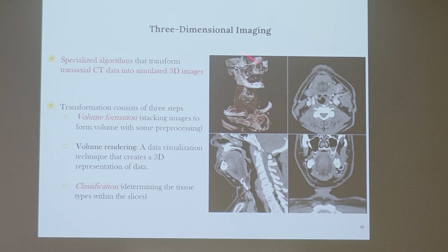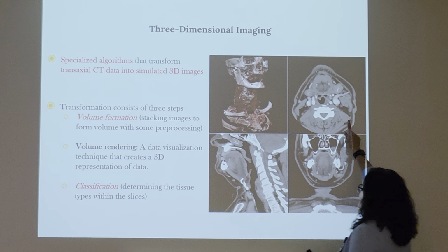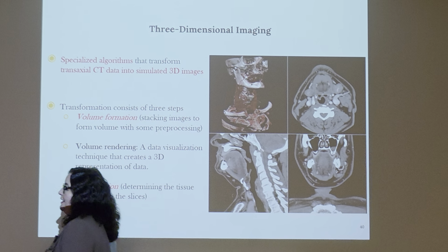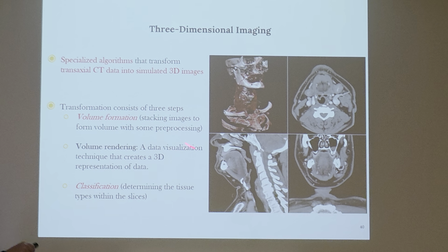3-dimensional imaging, again, this is something that starts from where? Okay, it starts from the axial image. What image is this? Sagittal, okay. And then you have 3D reconstruction. This is where we have the ability to start adding color, right? We're getting out of the monochromatic type of display. We're now looking at images in color, right? That's software.